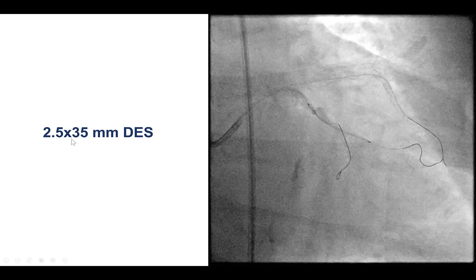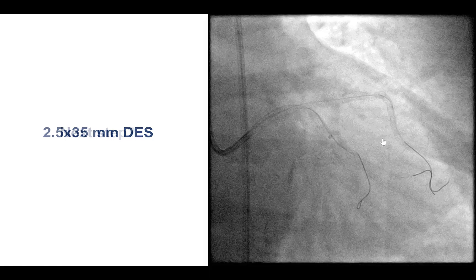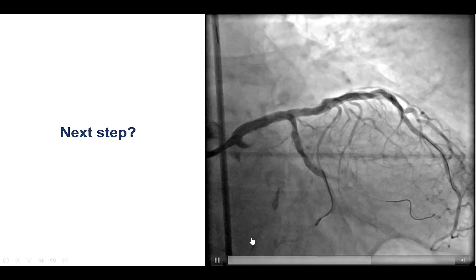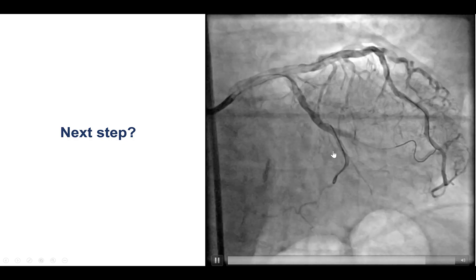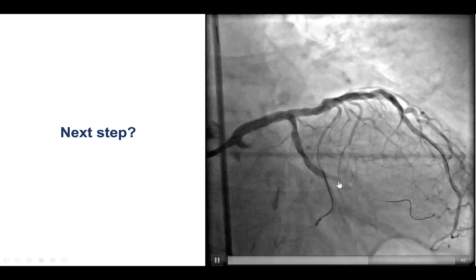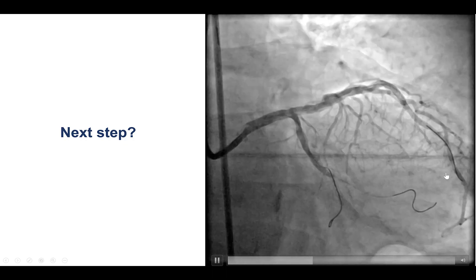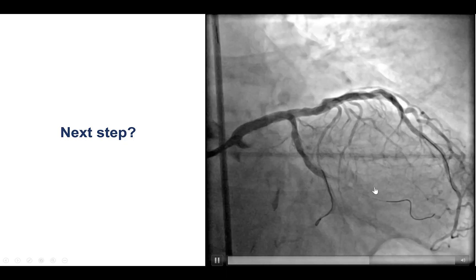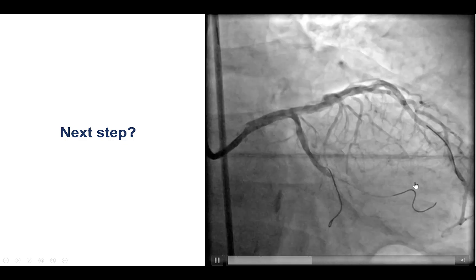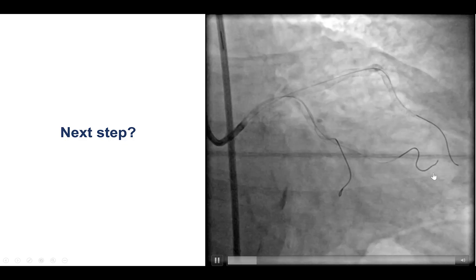We decided to stent, and delivered a 2.5 by 35 mm drug-eluting stent that was deployed. Unfortunately, there was flow into the inferior branch but no flow into the superior main obtuse marginal, which meant that the wire was actually not in the true lumen but was still in the sub-intimal position.